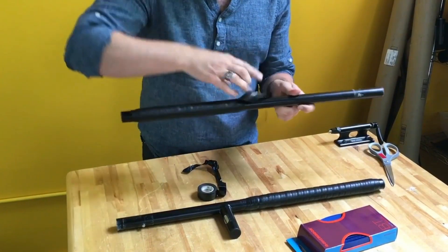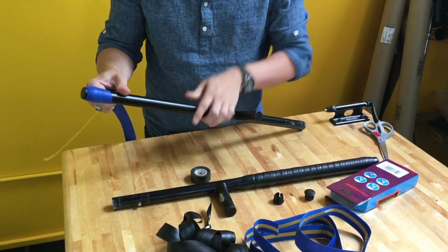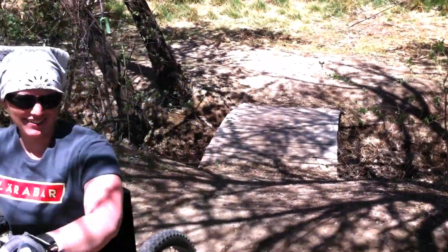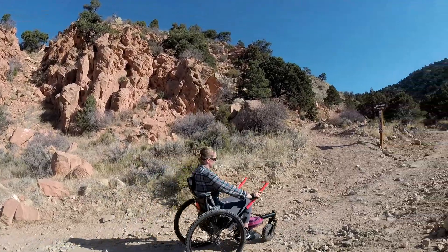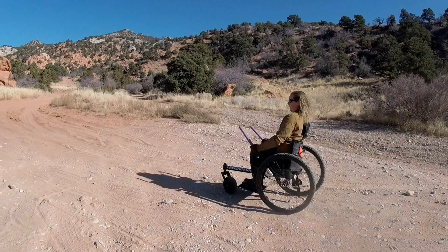The levers are also one of the places on the Freedom Chair where you can let your personality shine through a little bit. Through normal use, eventually the grip tape on them will need to be replaced. Grit offers many colors of lever wrap grip tape, or you can see what your local bike shop offers. The hardest part is deciding which color to get. Myself, I've gone through black, hot pink, white, and now I'm on to purple.